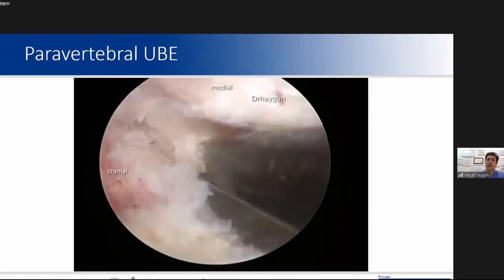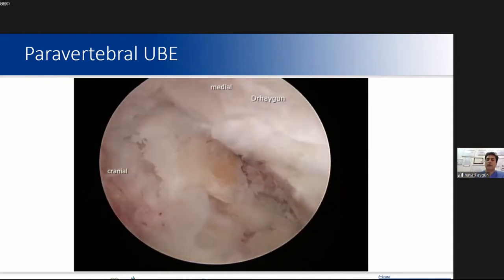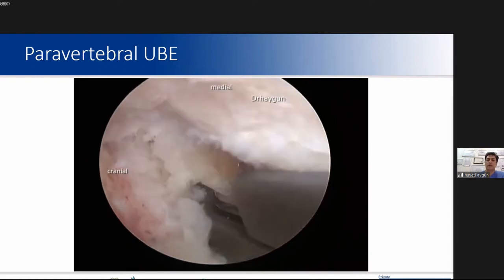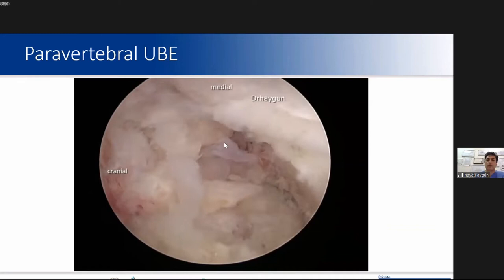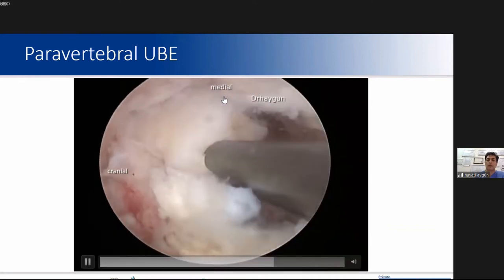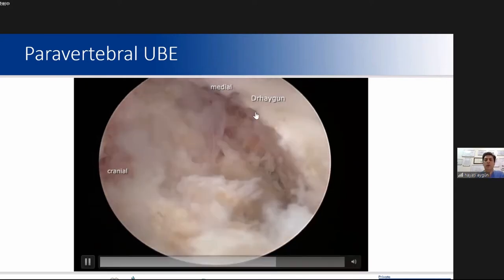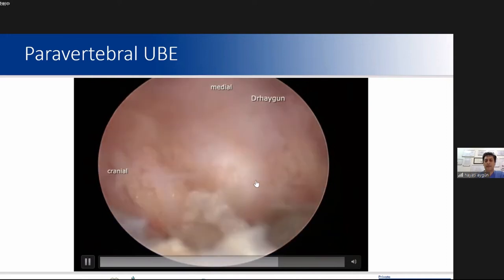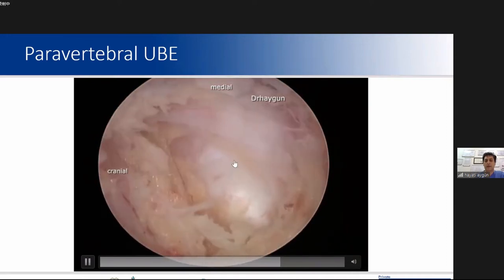By proceeding step by step, we can preserve the stability of the facet joint. The disc level is almost opened. Here is the disc.